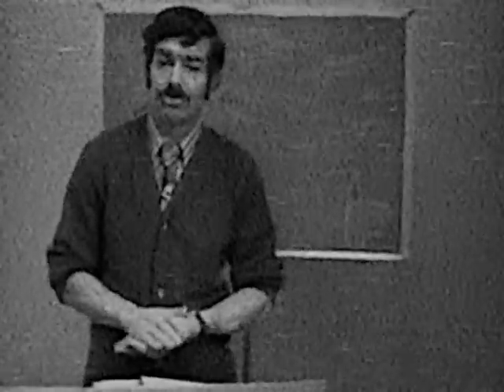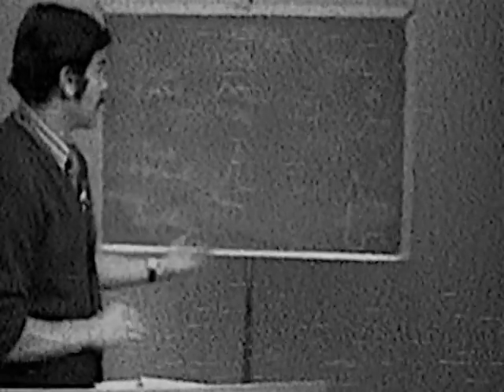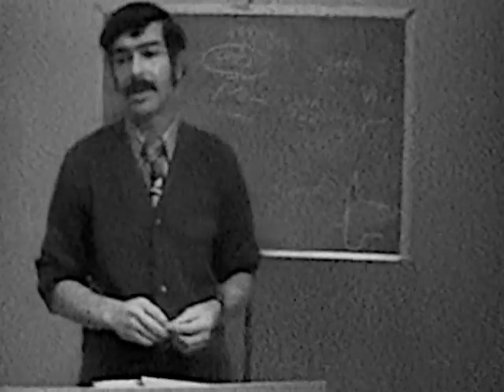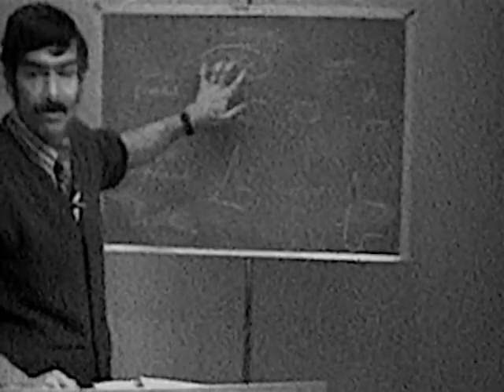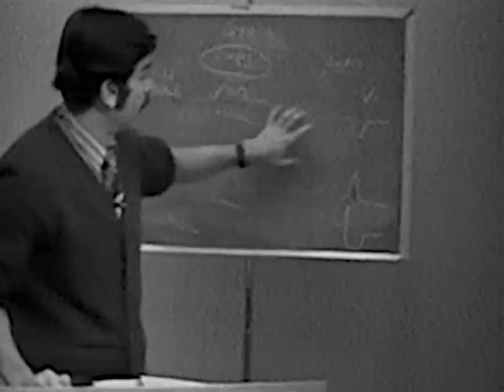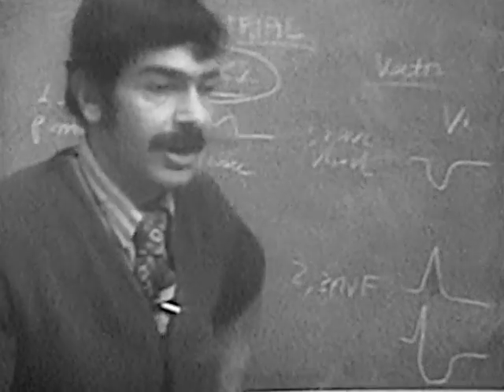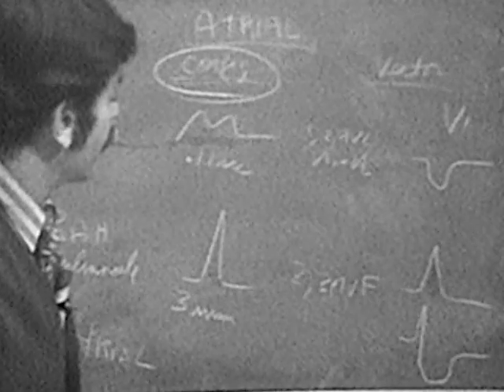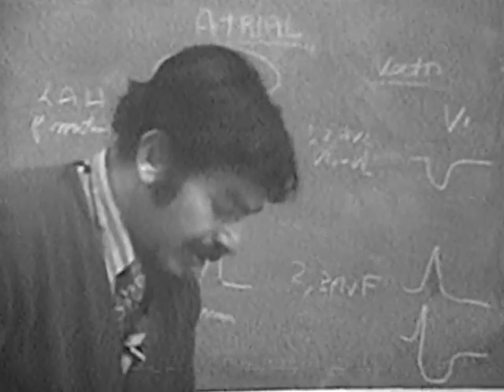So what do you do in that situation? Well, the thing to point out is that in terms of weighting, configuration probably has a stronger weighting factor in the diagnosis. So I'd pay more attention to configuration than the vector or the axis in terms of establishing a diagnosis or in terms of impression of what the patient has.